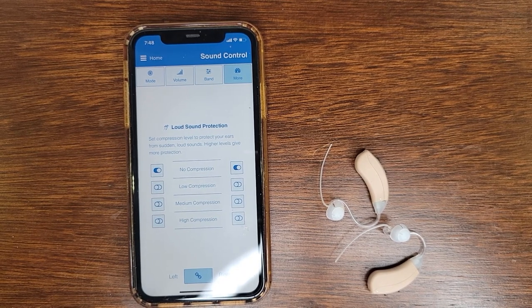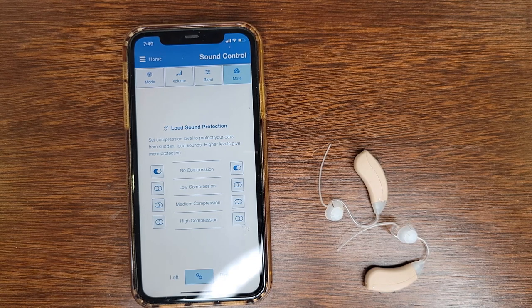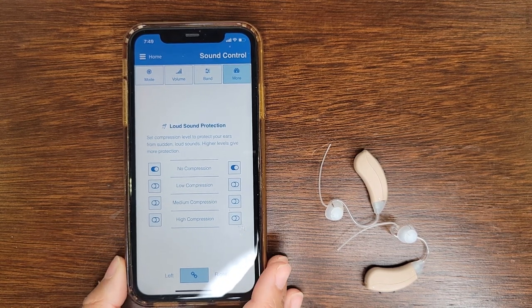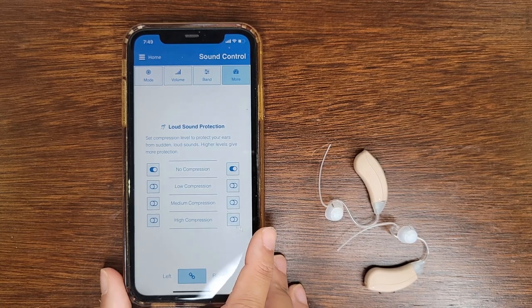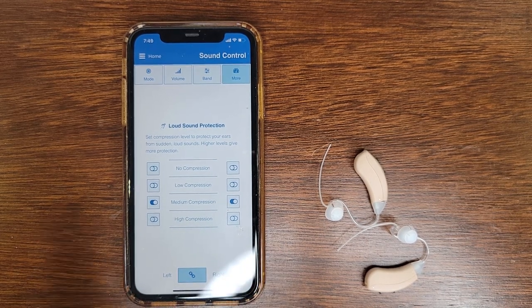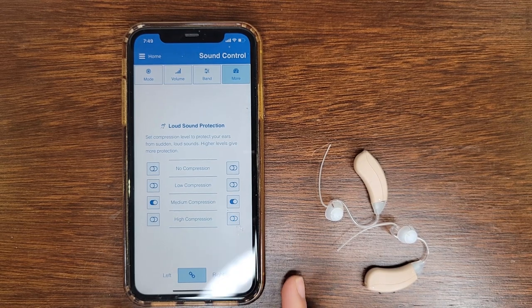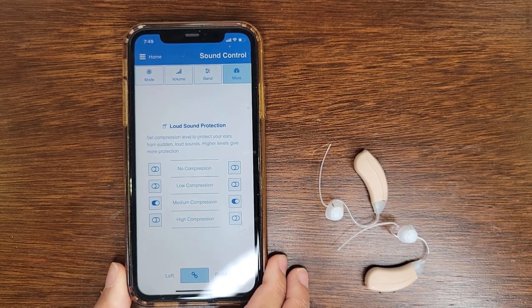So this is our loud sound protection or compression section, where you're able to protect your ear from hearing sudden loud noises, and you'll be able to pick up quiet sounds better this way. And the higher the compression, the more stable your sound will become. So basically, higher compression levels give better sound protection. So let's say I want to do the medium compression of loud sound, so it won't be as sudden when I hear them. Or you can do whatever you prefer.